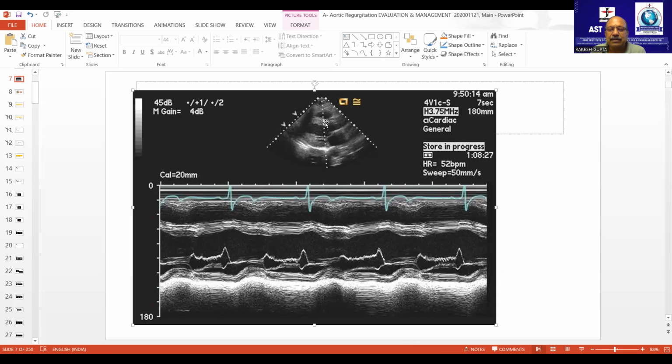Sir, when in the aortic cusp, that box also, we see the sawtooth appearance, then what is that? Aortic box, we see a sawtooth appearance. Yes, 2-3 patients I had noticed. My colleague said it's because of air. Aortic cusp, we see it, no? Yes, I got it. I'll have to look into it.